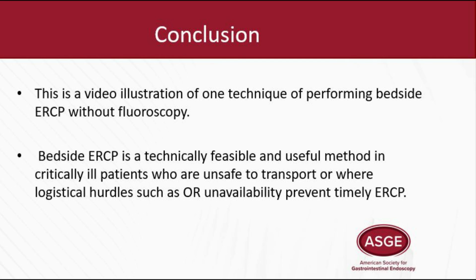In conclusion, this is a video illustration of one technique of performing bedside ERCP without fluoroscopy. Bedside ERCP is a technically feasible and useful method in critically ill patients who are unsafe to transport or where logistical hurdles such as OR unavailability prevent a timely ERCP.